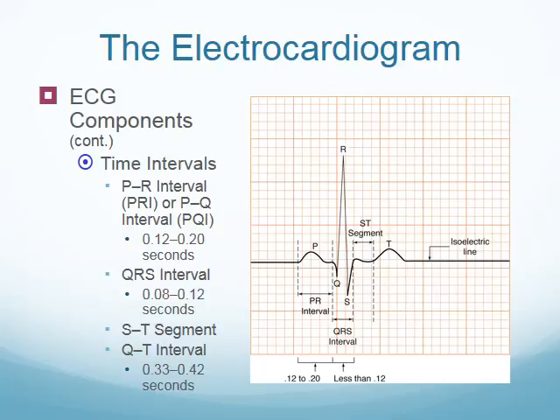Our ST segment is right here. Important to remember that our ST segment should be at the isoelectric line, which is right here. Our isoelectric line, and should not be elevated or depressed.